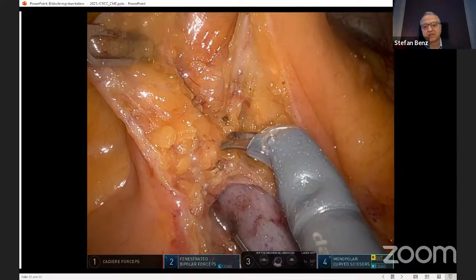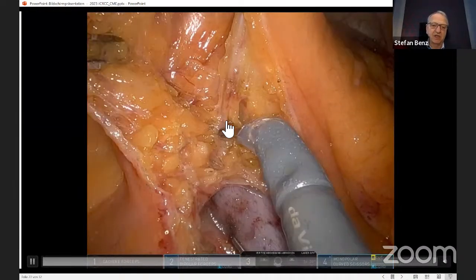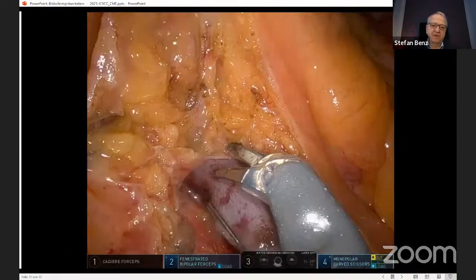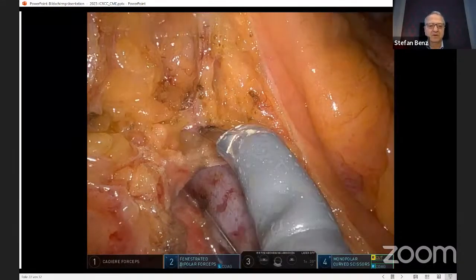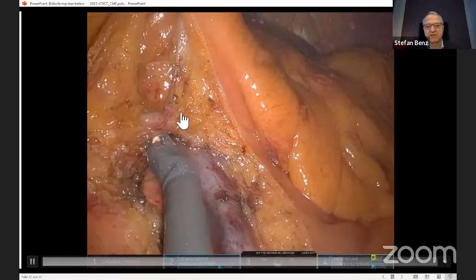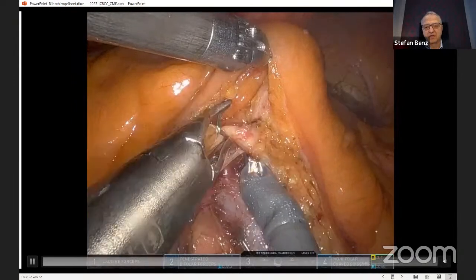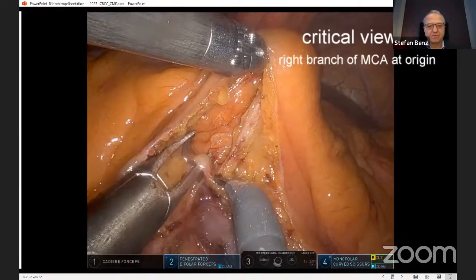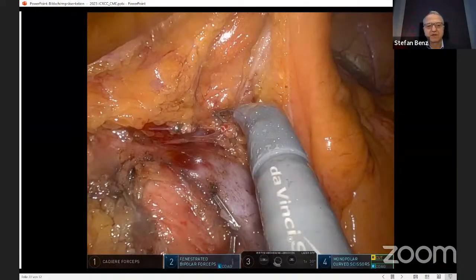the mesocolon. You retract it cranially, and usually you will find a right branch of the middle colic artery down here. This is dissected. And this very often takes quite a long time because it's very often not very obvious where this vessel is. And you see this is a quite strong and thick branch of the middle colic artery. Put a clip, divide, and then this concludes critical view number 7.